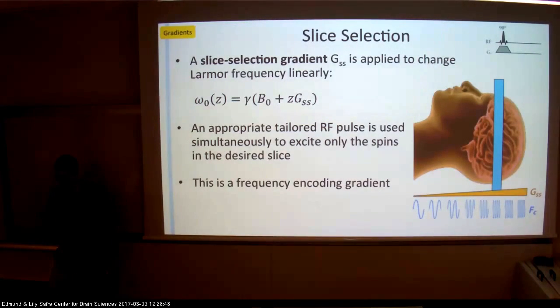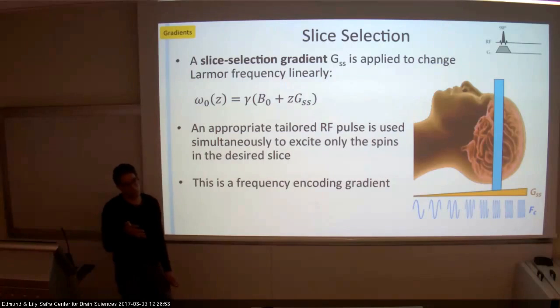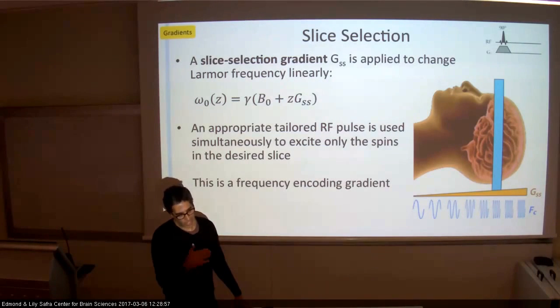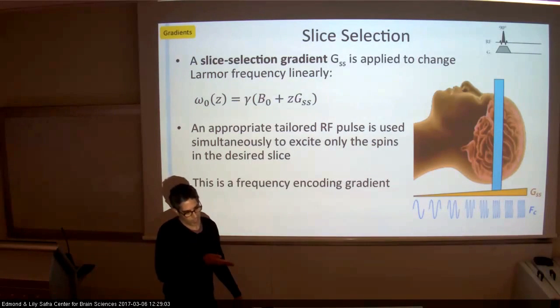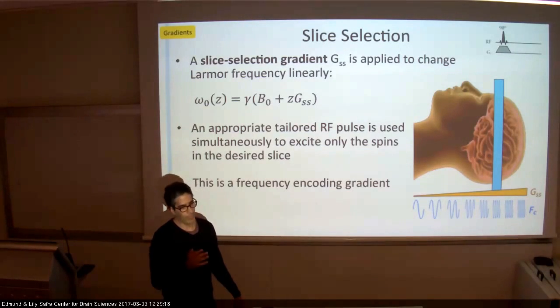How do you know the frequency related to? So I know what is magnetic field strength. I know what is the Larmor frequency. I can actually measure it, and then I know that my gradients are linear. I know how long I turn them on, and so that gives me how they will vary in space. What is the variation that I'm going to get in space? So according to that, I'm going to say, okay, this is Larmor frequency plus some epsilons plus some energy, and so if I'm exciting in here, I'm going to get this specific size, roughly.